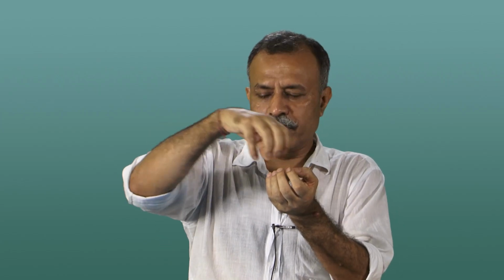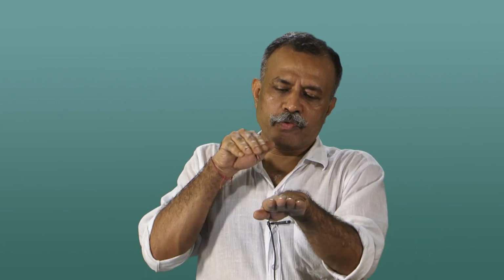So, it has to flow. It's almost like a flow cell where you have an adsorbent on which the analyte is going to bind. Essentially, you have a surface on which you have very specific binders sitting there. Now, you flow your sample on top of that.